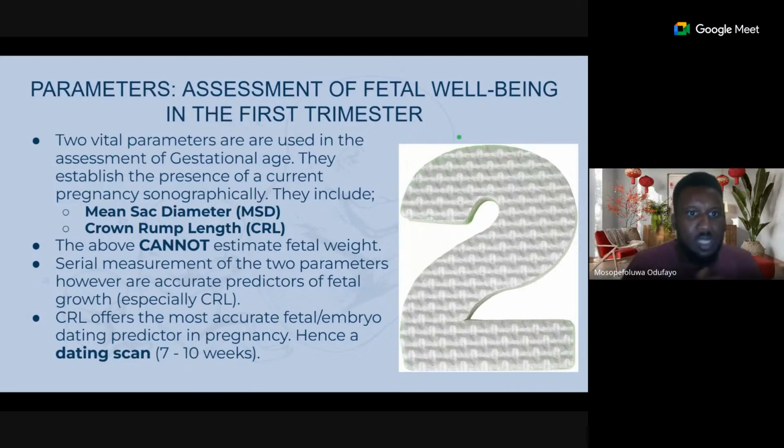Let's now talk about the parameters proper that we'll use to assess the developing anatomy, the embryo and the sac that surrounds it. We have 2 parameters we use, yeah? If you're enjoying this lecture, you can share with your people so they can also join in. There are 2 parameters that we use apart from the heart rate. Well, the heart rate just helps you check whether it's alive or not alive.